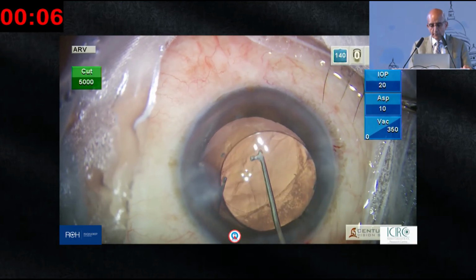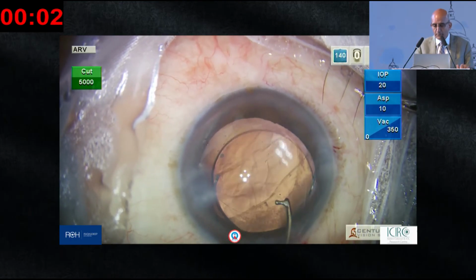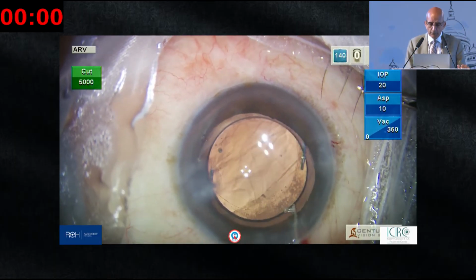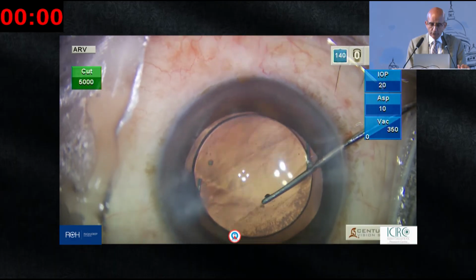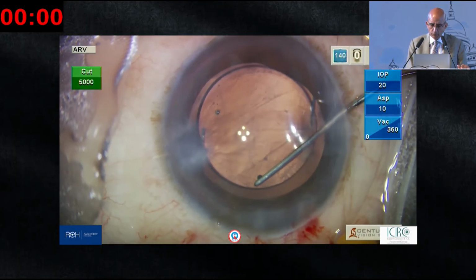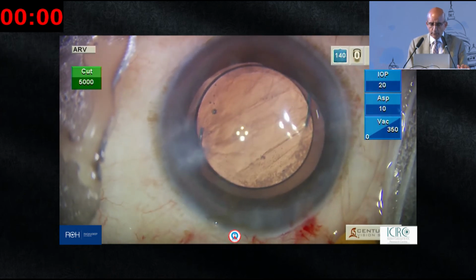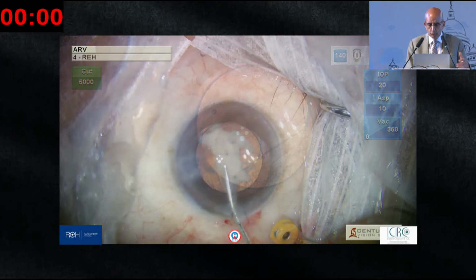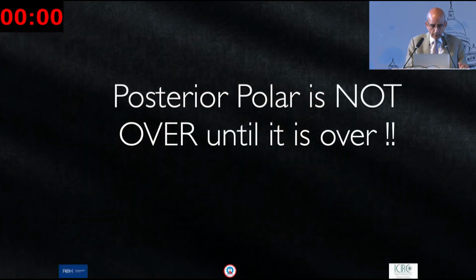I've used them since before some of you were born, so I'm used to these forceps. This, once again, capturing the optic, pushing it posteriorly and nudging it in such a way that this tear, posterior capsule and the anterior capsule, both are anterior to the optic, and the IOL is very stable, needs no suture. Make sure that there is no triamcinolone, and that's it.